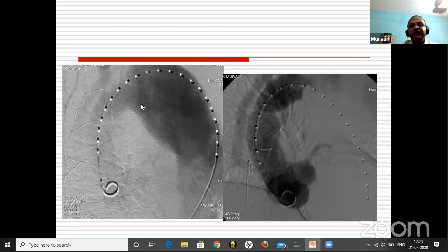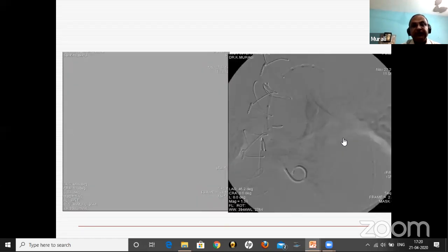So you have to be very, very careful in navigating the wire. You use all the techniques which you have, either fluoroscopy or your transesophageal probe, and this was sorted out with the TE probe. And then finally we got the wire inside the true lumen. This patient basically had the ascending aorta replaced with arch debranching done. We took the patient the next day for this treatment.